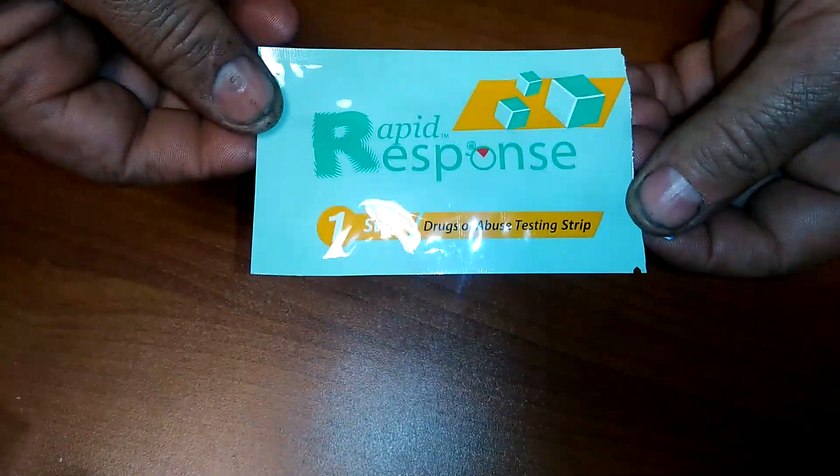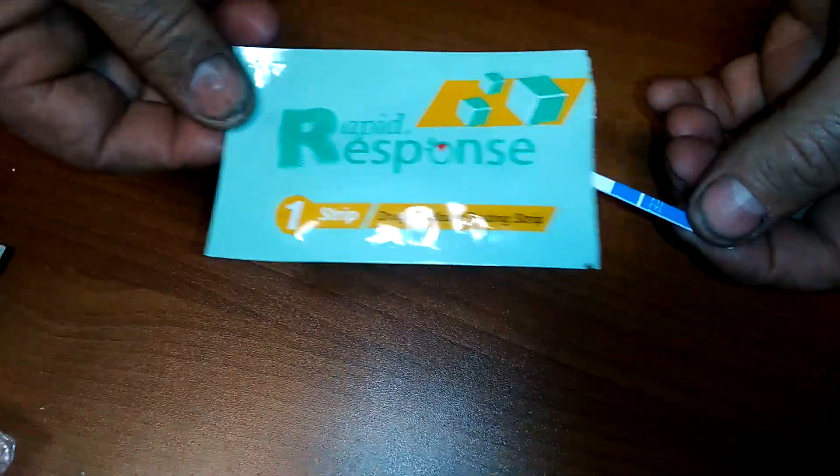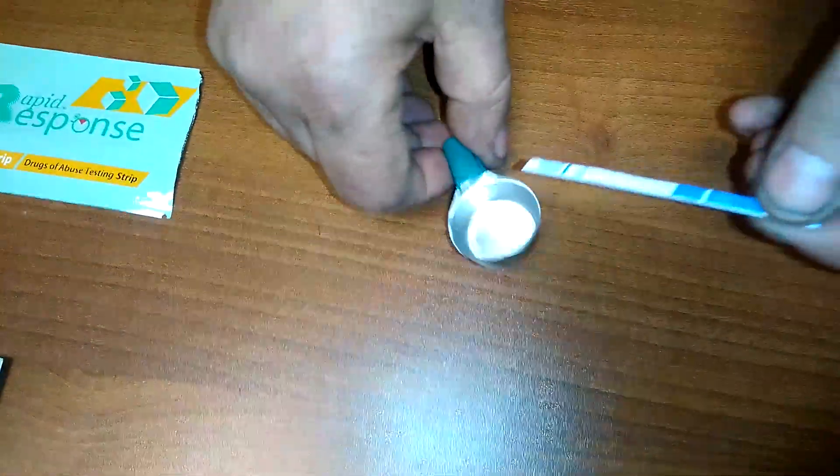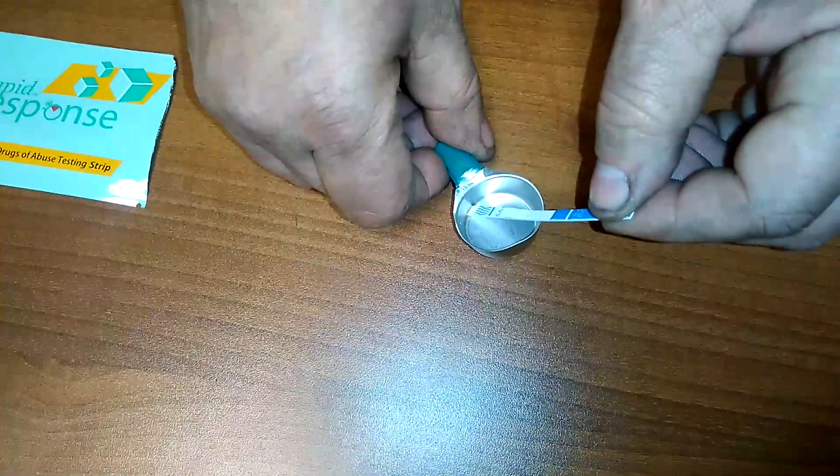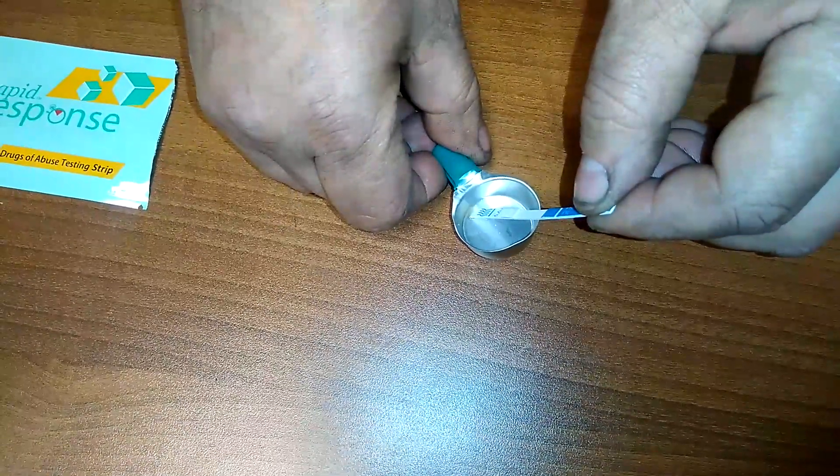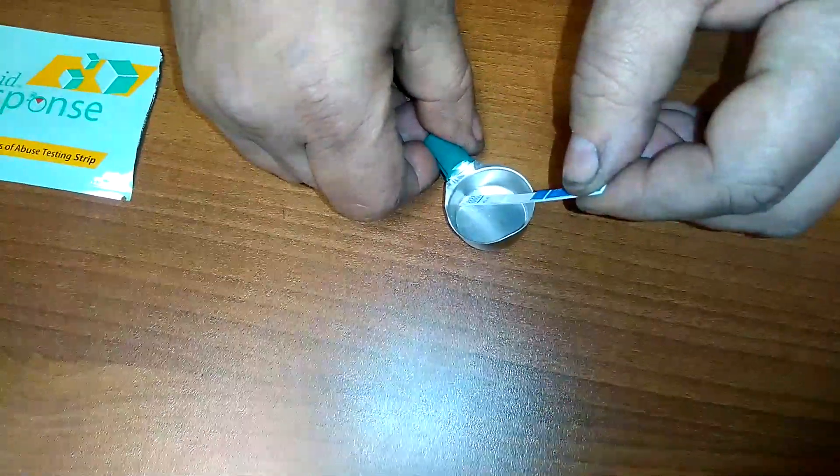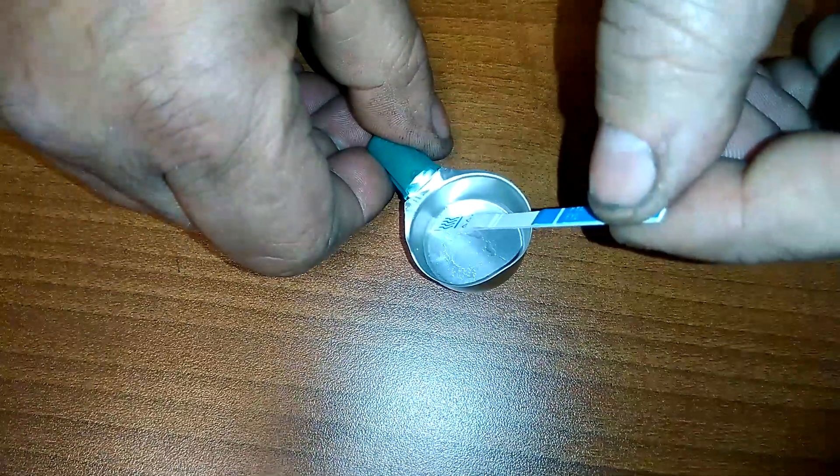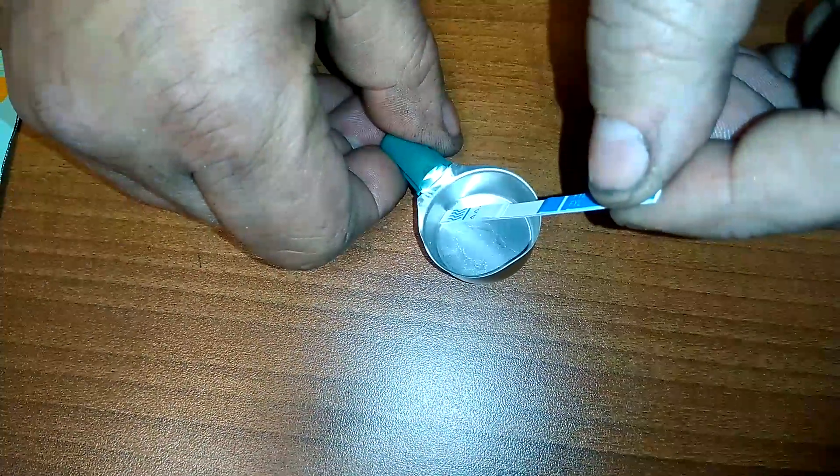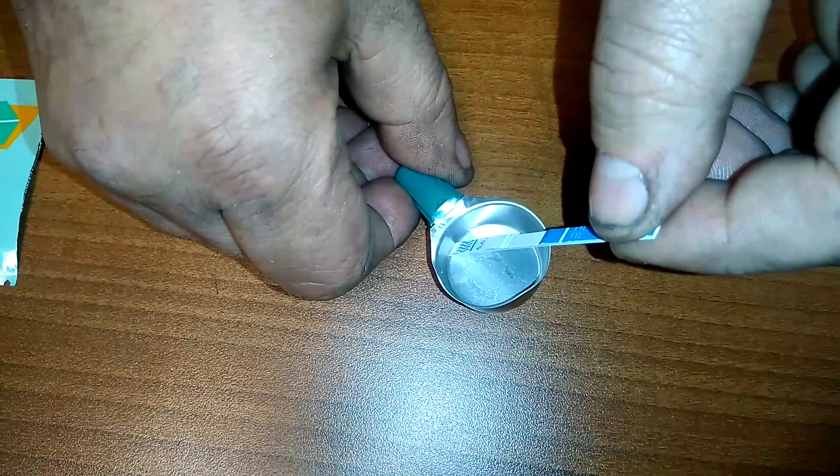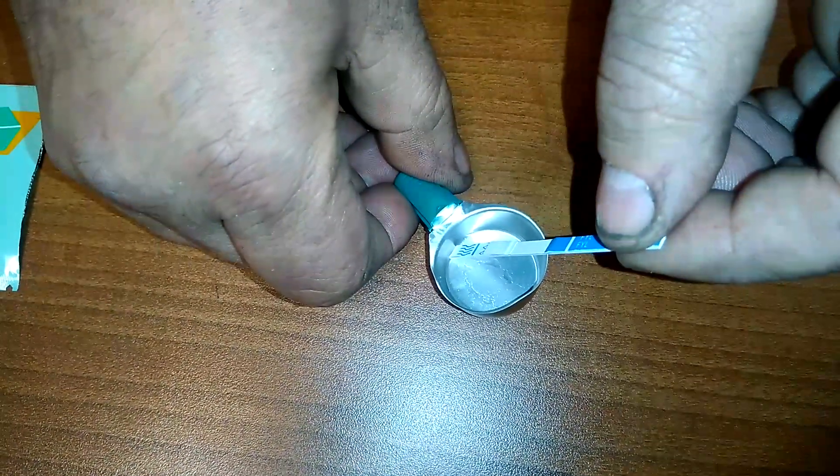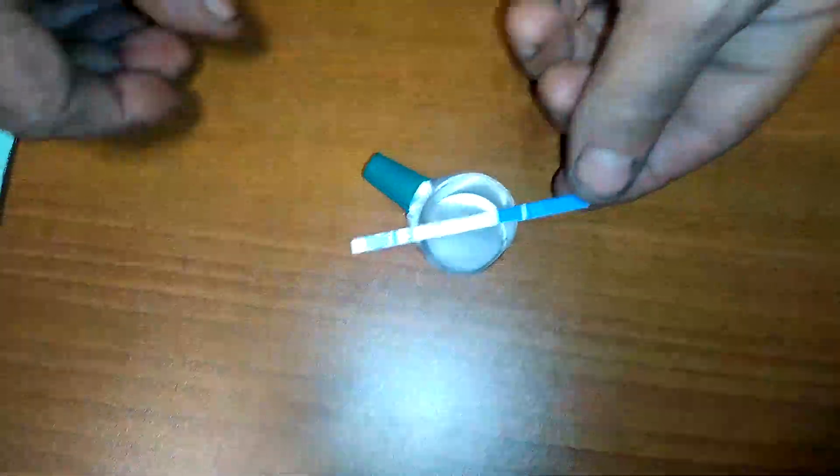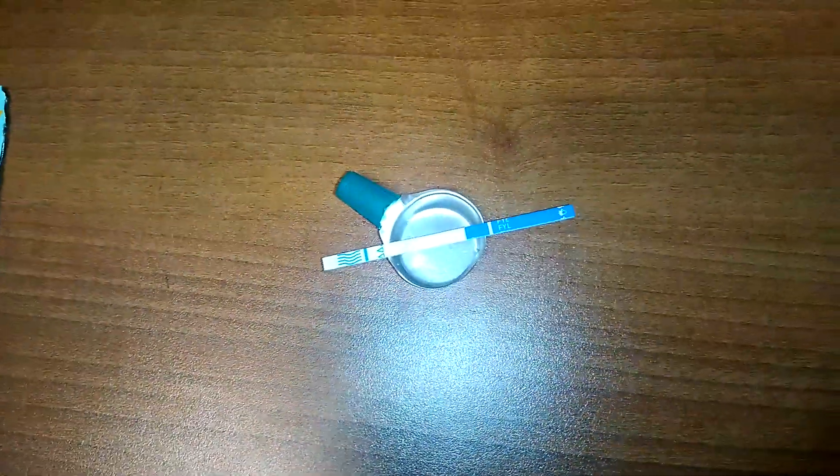All right, this is test number four. Again, residue, totally different bag, also from the Bronx. We're just gonna let it sit in there for like eight seconds. It'll soak up. So we're gonna do the same thing. This is number four. Same thing, testing the residue. The shot was already drawn out and now we're just waiting for a negative or positive test. This is also from the Bronx.